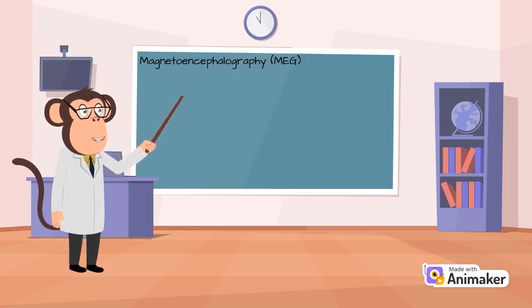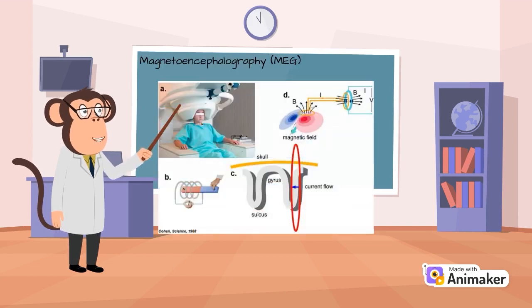Magnetoencephalography is a non-invasive medical test that uses a superconducting quantum interference device and a computer to measure neuromagnetic activity within the brain. Magnetoencephalography detects, records and analyzes the magnetic fields produced by electrical currents in the brain. The distribution of these magnetic fields is superimposed with an anatomical image of the brain to help identify the source of activity in the brain.